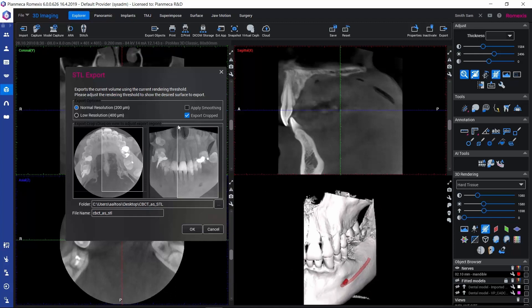After we have set all our preferences, we can browse for the folder. I already have a default folder to which I'm going to export my surface model, but if we'd like to browse for the right folder we can click on this small box here. We can also specify a file name. Let me modify my file name a little bit, and then when everything is ready, let's click OK to export this model as a surface model in STL format.